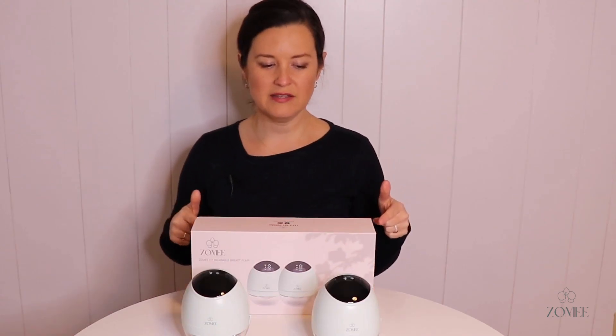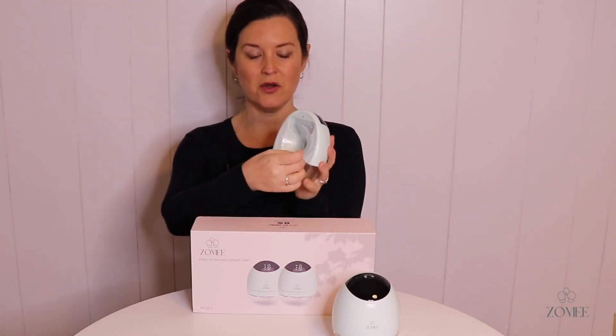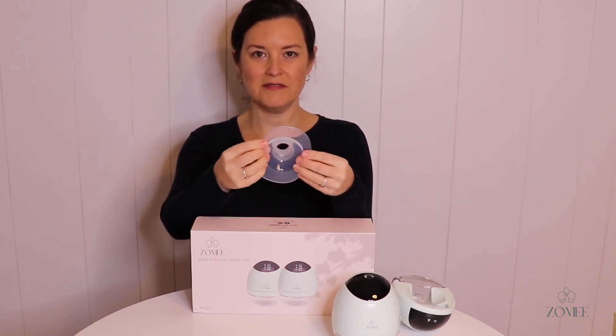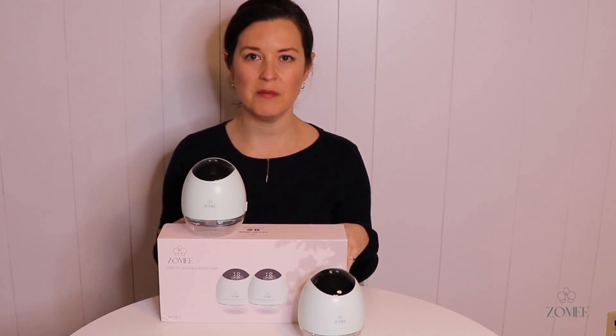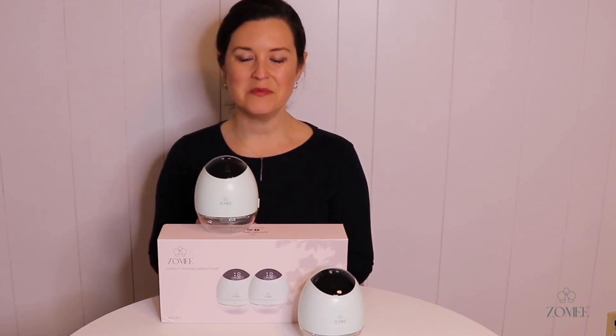First, let's talk about everything the pump comes with. It comes with two motors, the collection cups, and a soft silicone flange — I'm going to pull this off so you can see. It's a nice soft flange for increased comfort, and it comes with two flange insert size options: 17 and 21. So for those who need smaller flange sizes, there are options included. Some great features are a leak-proof system and anti-backflow protection.